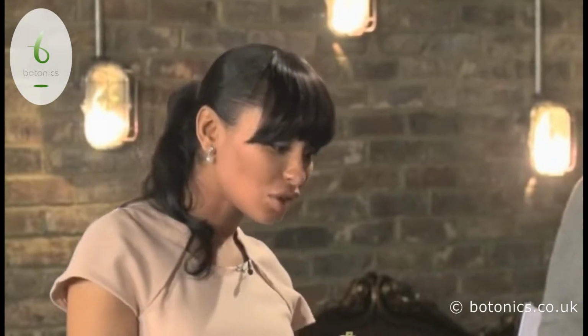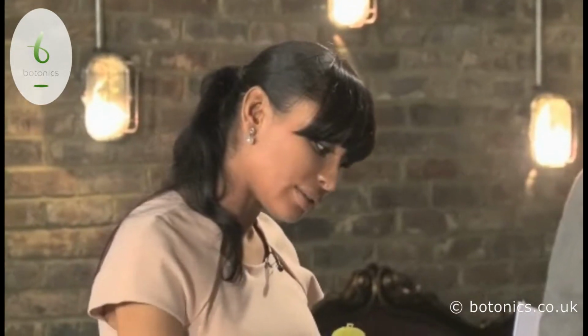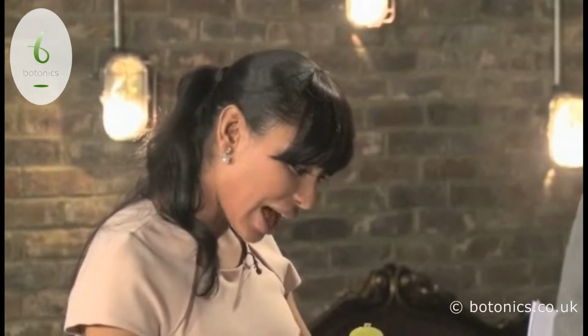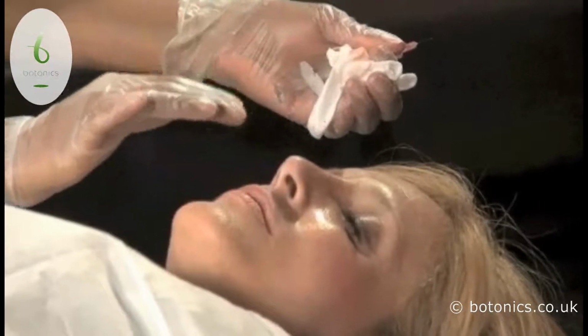Absolutely, it's just like that, except we're not going under the knife, so we're not opening the nose, and we're just doing some simple injections to manipulate the shape of the nose and perfect all the little areas where it's a bit unsymmetrical, to make it straighter from the profile and looking at the nose straight on. And we're also going to lift the tip a little bit. The tip's a little bit going off to the left, so we're going to straighten that for Isabella. And we're also going to correct this little area below the tip as well, so that we have that consistency going all the way through the nose.